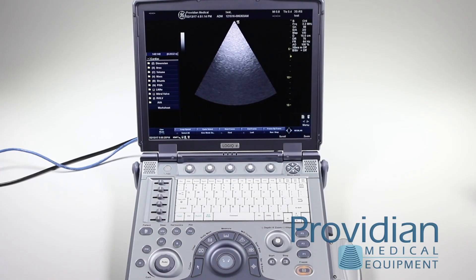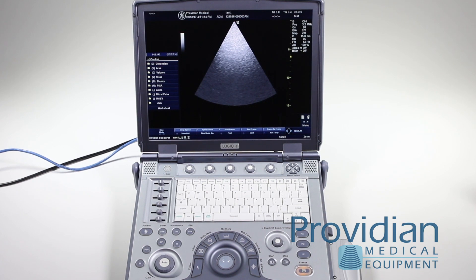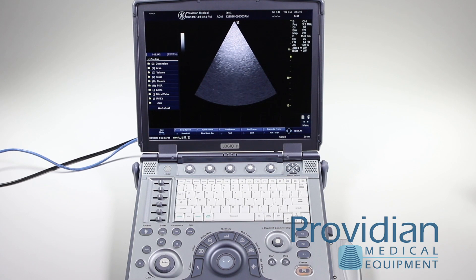Before we get started on setting up DICOM and connectivity on the GE Logic E, there are a few things you need to get. First, you need to speak to your IT department, get an Ethernet cable, and make sure you can get a connection in your office. Then find out if they're using DHCP or if you need a static IP address.